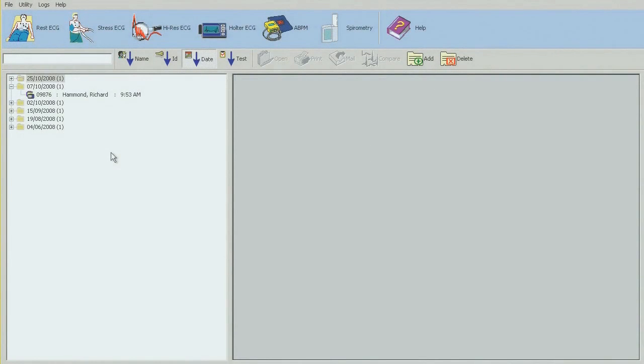I'm analyzing patient Richard Hammond. Double-click on the patient name to open the study.